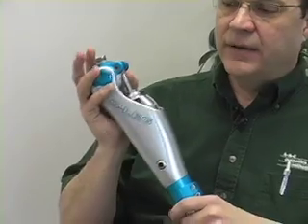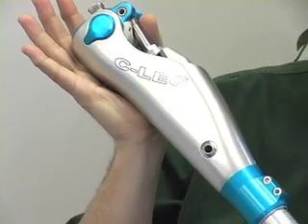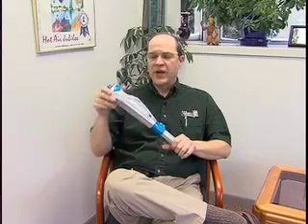Today I want to talk about the microprocessor knees for use in above-the-knee amputations. In 1997, Ottobock introduced the first commercially available microprocessor knee, which was this unit here, the C-leg. There are now quite a number of other units that are out there. This still remains one of the very most popular and very successful.